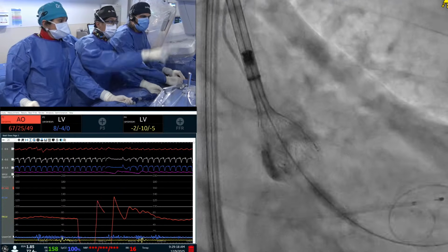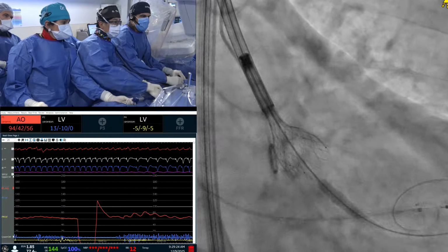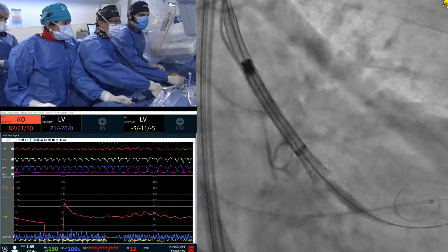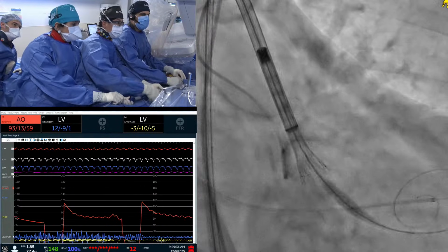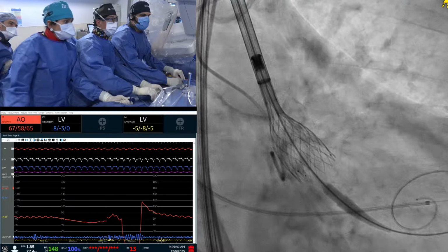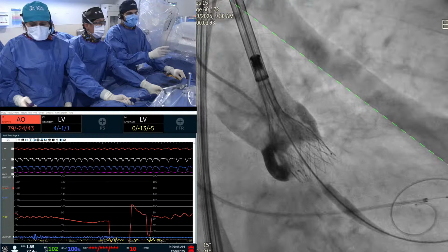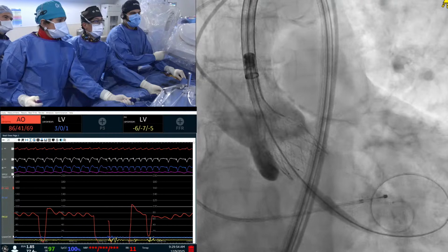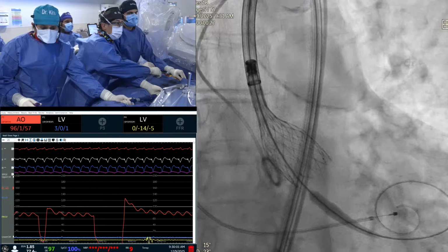Okay, inject, please. No, no, no, high. Came up. Okay, go down. Push the wire a little bit longer, please. Pacing run. Okay, much better. Good. Inject, inject. Okay, now good, good. Too far down. Sorry. No, it's fine, it's fine. It may be okay. Floral, please, Dr. Skin. Good. That's actually good. It's actually free.